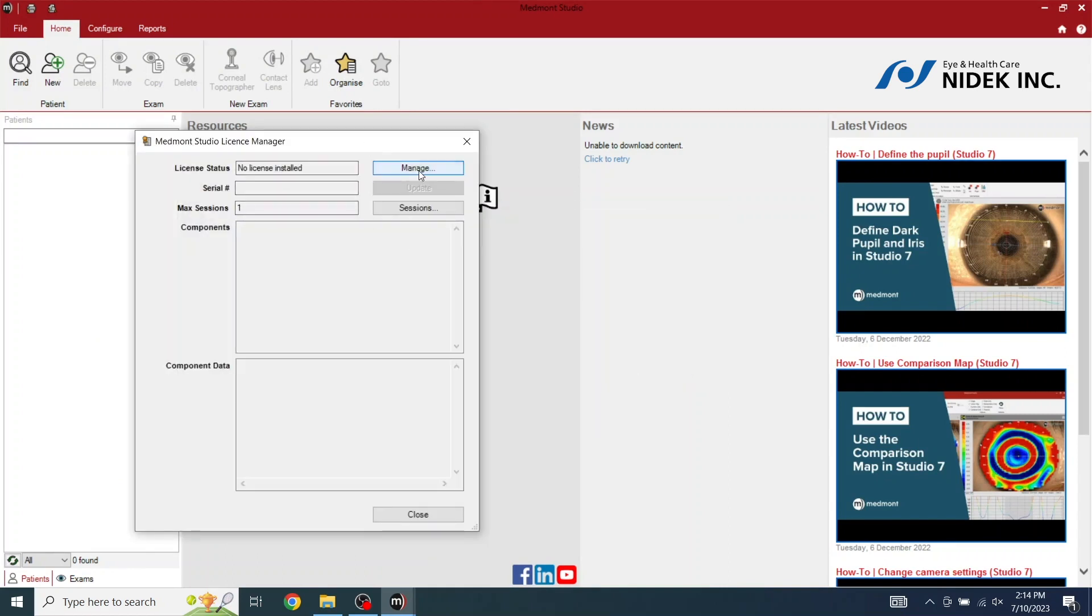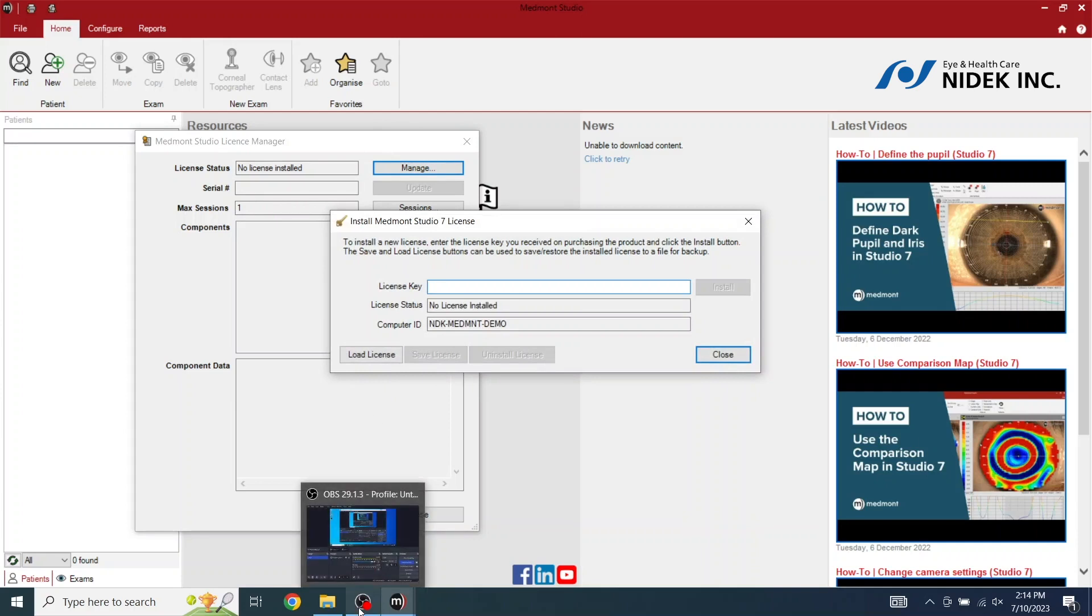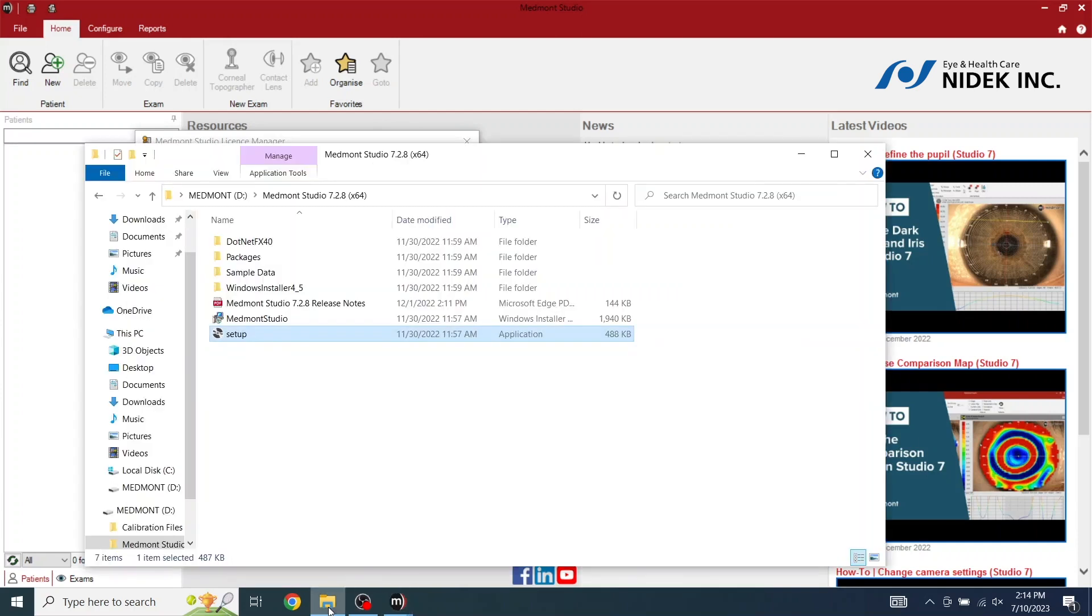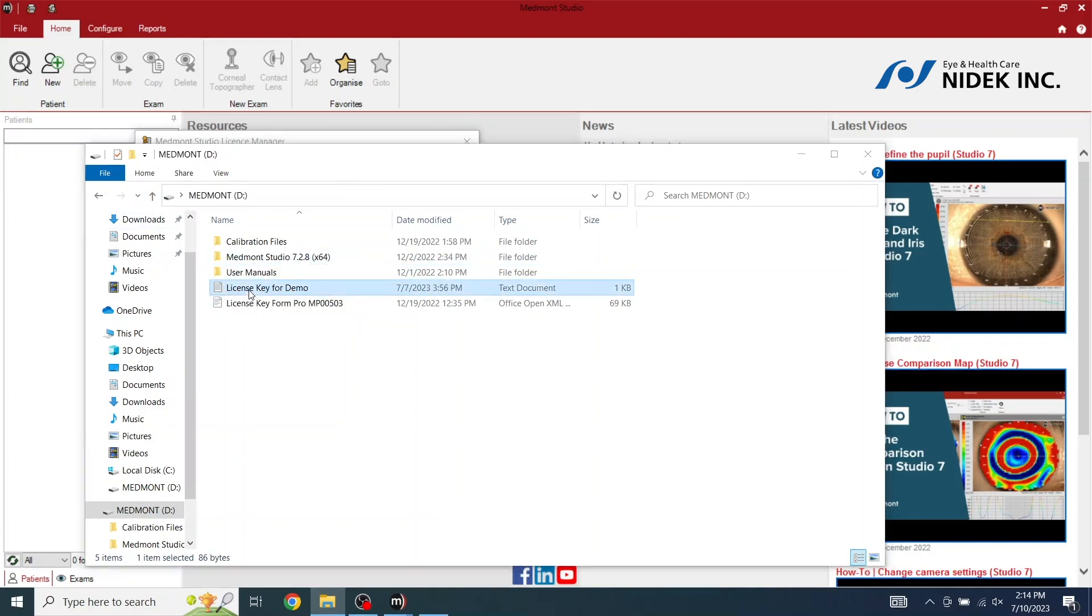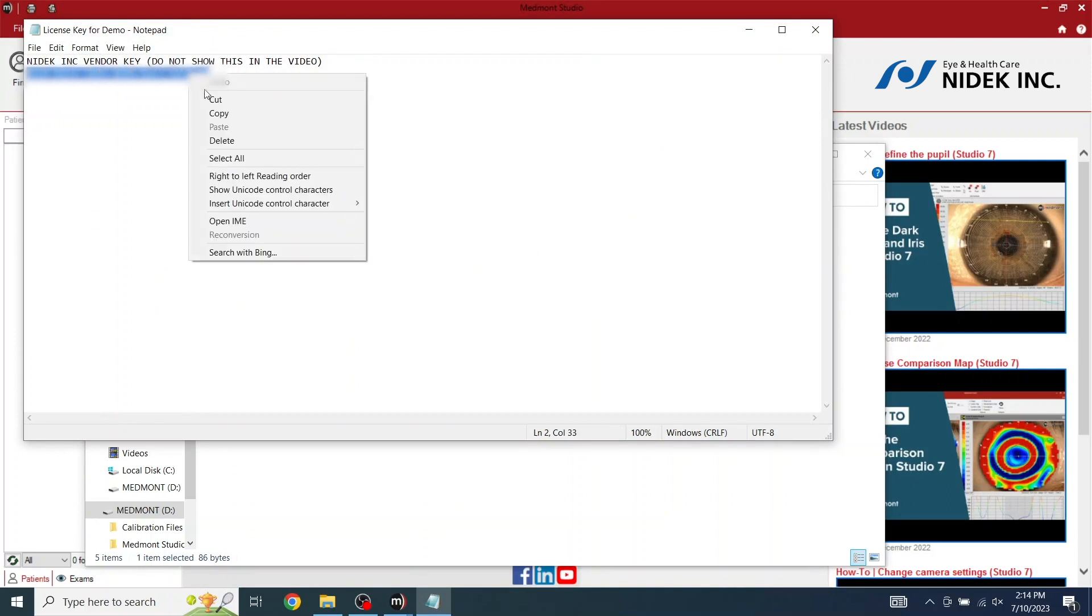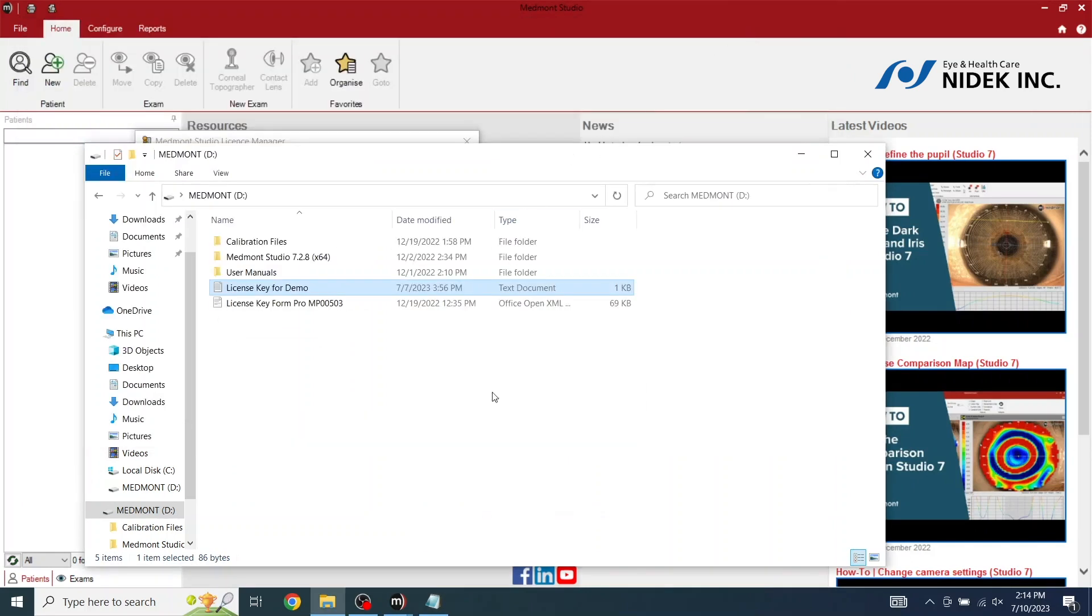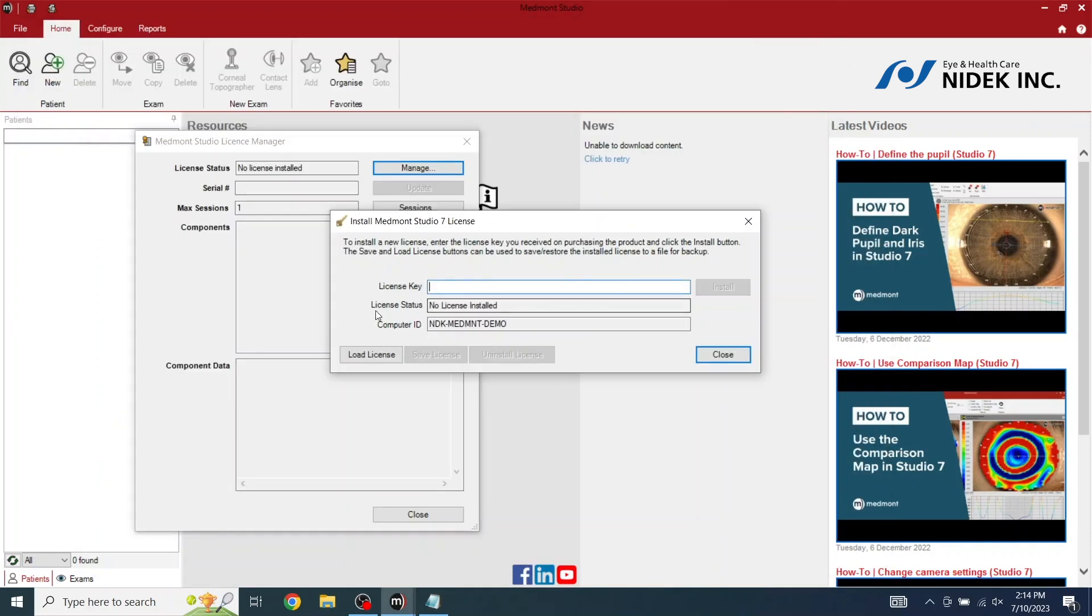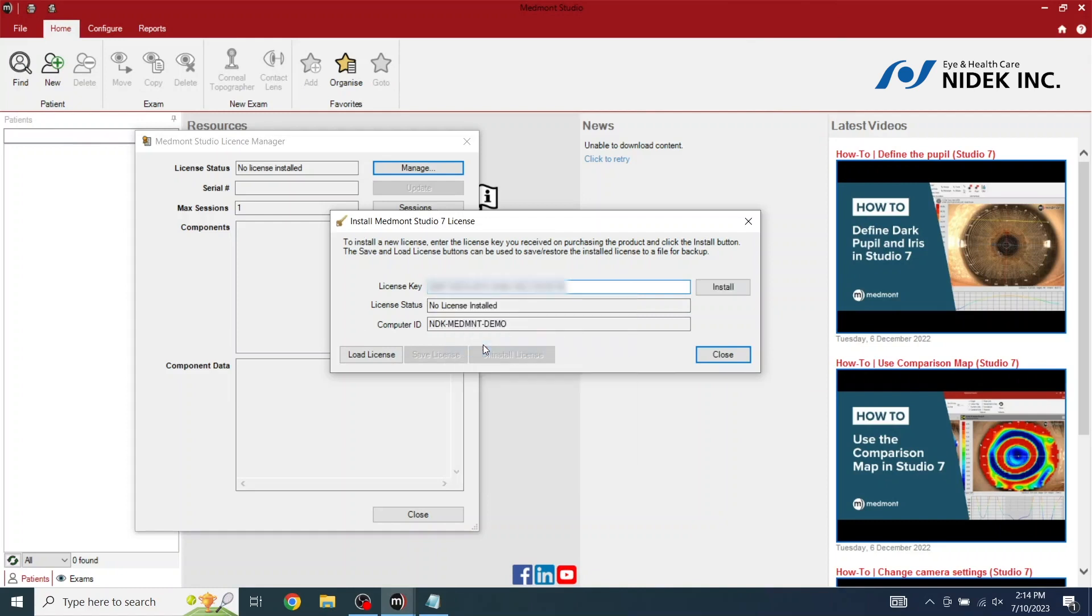We're going to install the license of Medmont Studio by selecting OK. We're going to select Manage. On your USB license key, we're going to go and select License Key. We're going to copy the license key number from here. Left click and hold. Right click. Copy. Minimize. And paste.